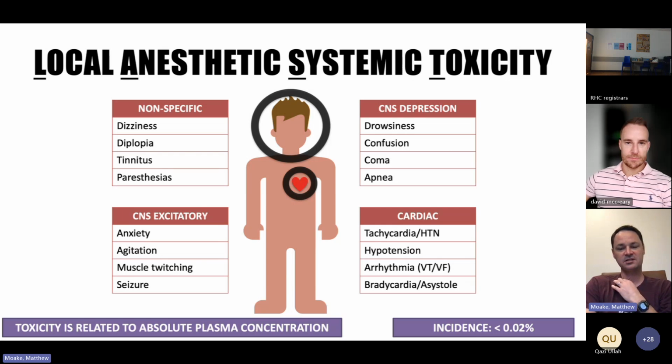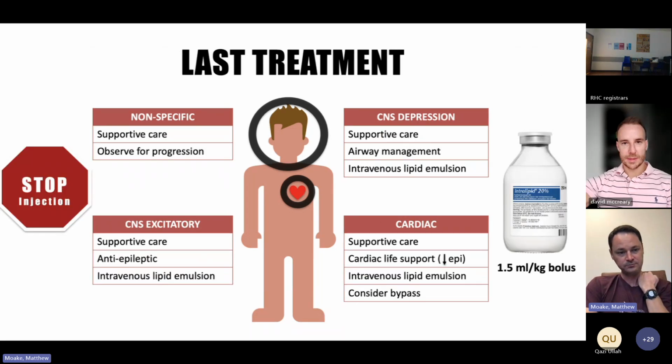Last, or local anesthetic systemic toxicity, is the biggest thing you need to be worried about. This is super, super rare. And in the world of ultrasound guidance, it really should largely not be happening if you're following correct protocols and visualizing your needle as you do it. LAST can be very nonspecific, but it can also be very serious, with major CNS and cardiac symptoms that go all the way down to seizures, arrhythmias, and arrest.